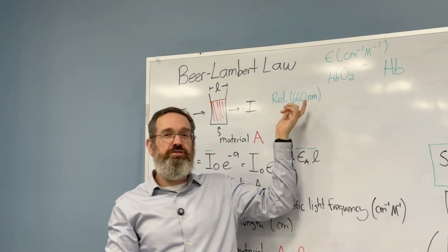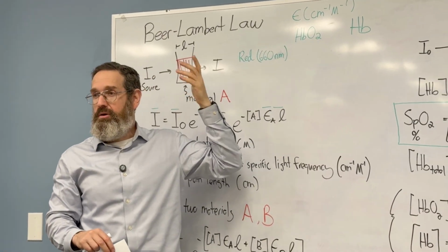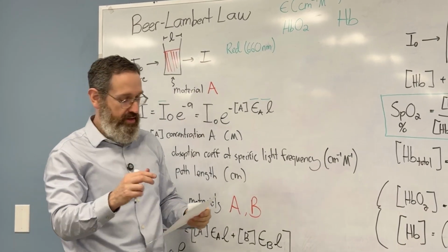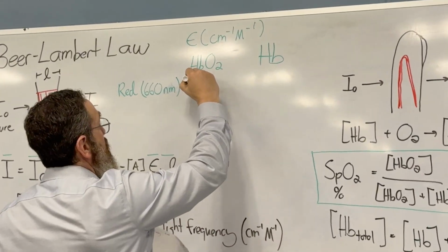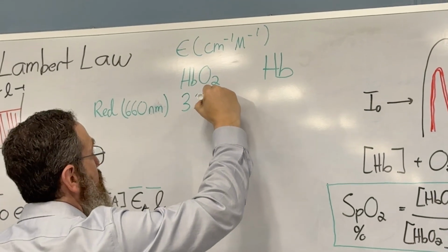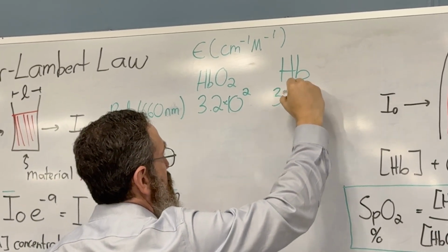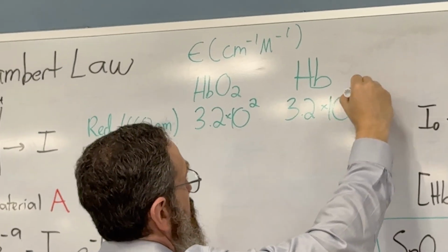If you say, well, why don't they just give frequency? I think honestly one reason is the frequency would be a big number, like a billion, gillion or something like that, and people don't like to do that. And so it turns out you get numbers here of, I believe, 3.2 times 10 squared, and this one is, by coincidence, also 3.2 times 10 to the third.